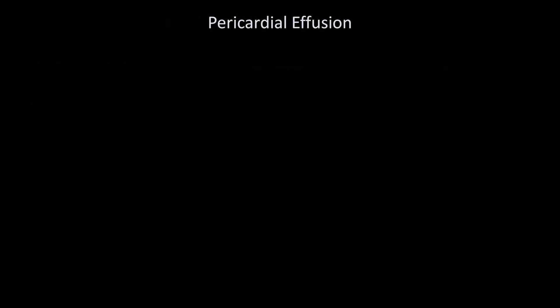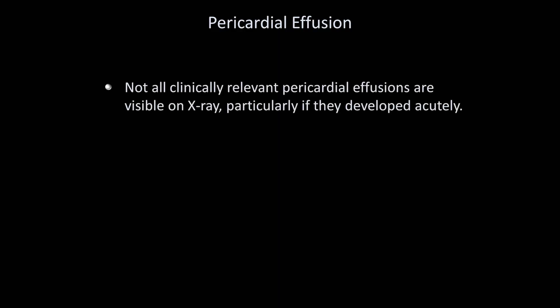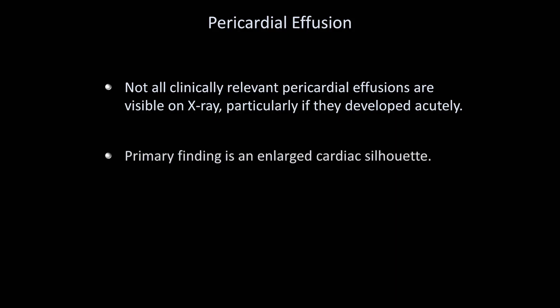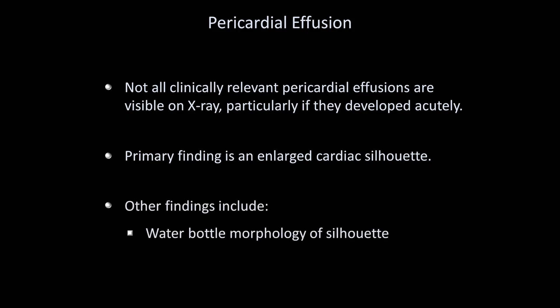Moving on to pericardial effusions: not all clinically relevant effusions are visible on x-ray, particularly if they developed acutely. That's because pericardial tamponade — a condition where diastolic cardiac filling is impaired due to high intrapericardial pressure — is dependent on both the volume of fluid within the pericardium and the speed with which the fluid accumulated. The primary finding of an effusion is an enlarged cardiac silhouette. Other findings include what is frequently called the water bottle morphology of the silhouette, as well as the Oreo cookie sign.